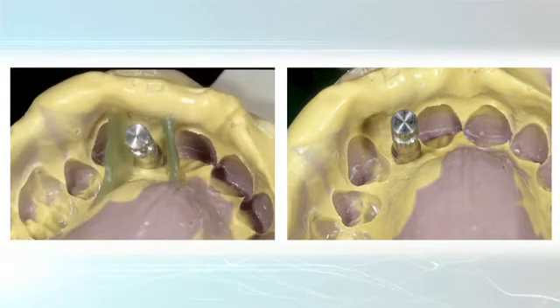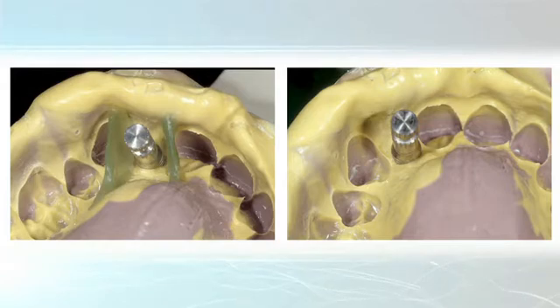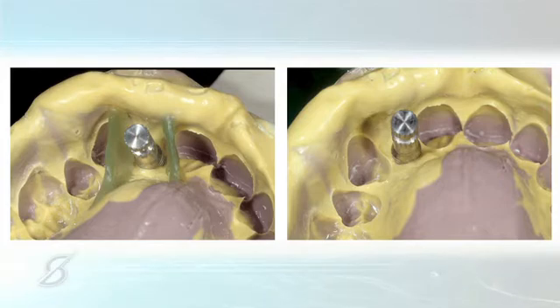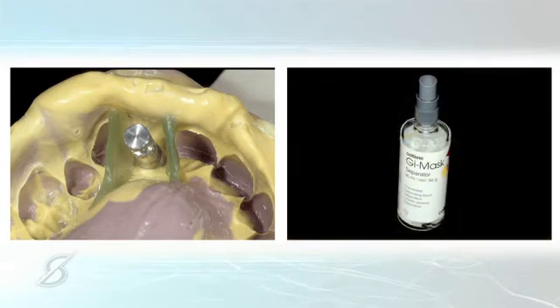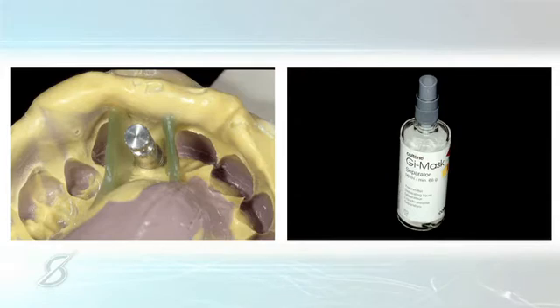One thing that I usually do is take a little green boxing wax and lute it to the silicone so that I can inject the pink silicone gingiva right down around it. But you do have to use some separator, and whatever pink silicone you're using will come with a separating agent so that the pink doesn't adhere to your impression. In this case, it was a Coltene separator called GI Mask.